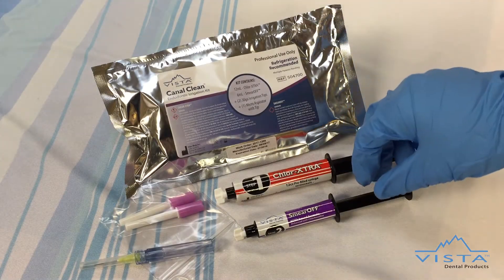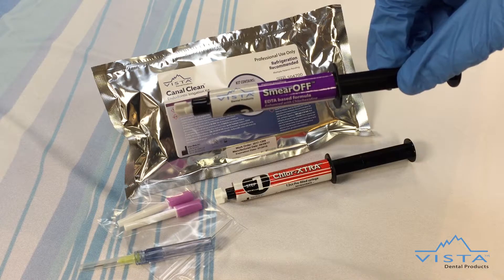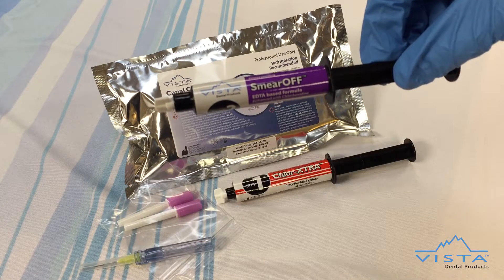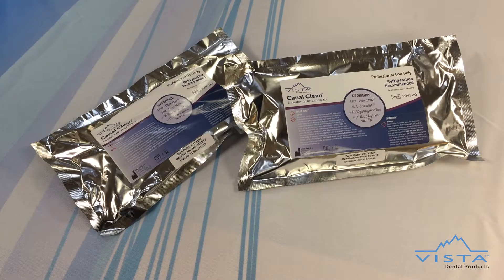The second step in the process involves our patent-pending solution, Smiroff. Smiroff is an EDTA-CHX mix that optimizes smear layer removal and provides a residual kill of bacteria in one step. When mixed with sodium hypochlorite, it will not form a precipitate, so there is no additional rinse needed.